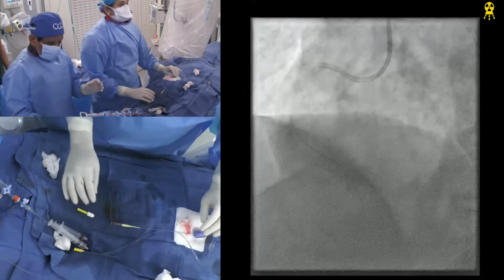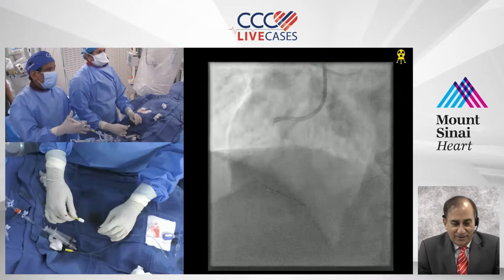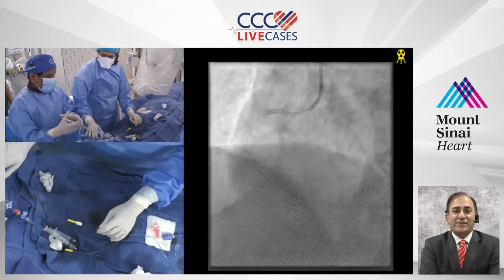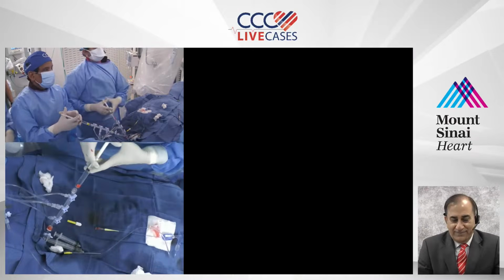Just to give you feedback, a chorus of people, including Dr. Harris and Nagao, are all saying it's time for retrograde. Okay. Okay. I'm injecting first.